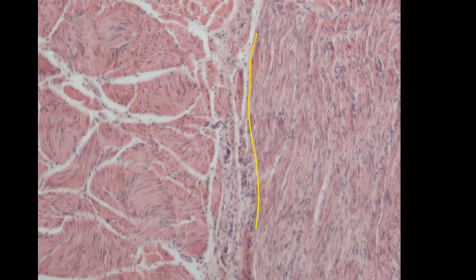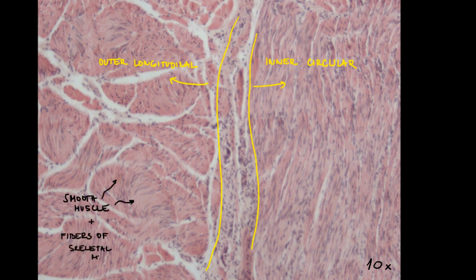Muscularis is divided into 2 sublayers. The orientation of cells in the internal sublayer is circular, in the external longitudinal. In the connective tissue between the muscle sublayers is another autonomic nerve plexus, the myenteric plexus or Auerbach's plexus.